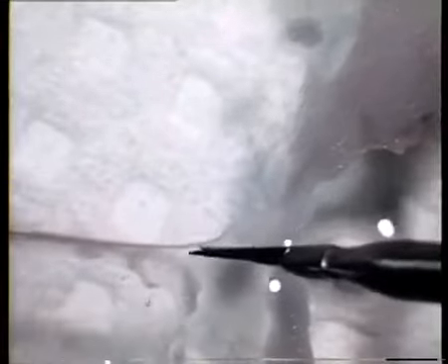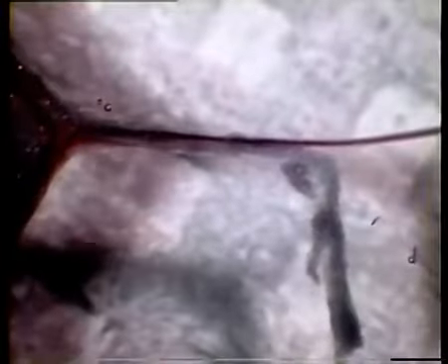The vein is being removed now together with a lot of the surrounding fat. As you cut closer to the artery, you need a larger magnification to avoid cutting into the vessel wall.